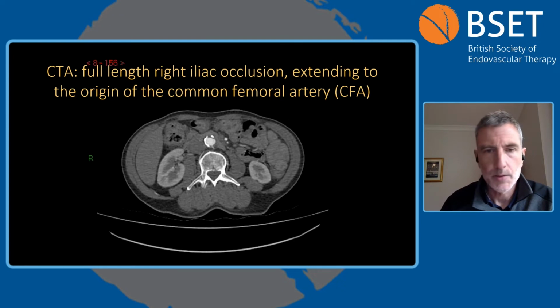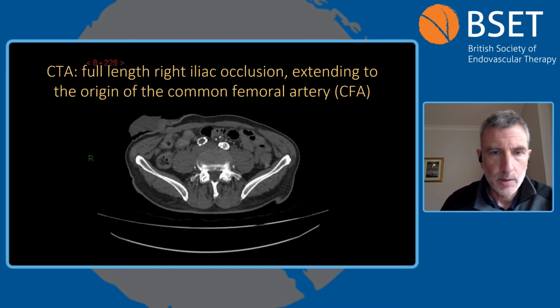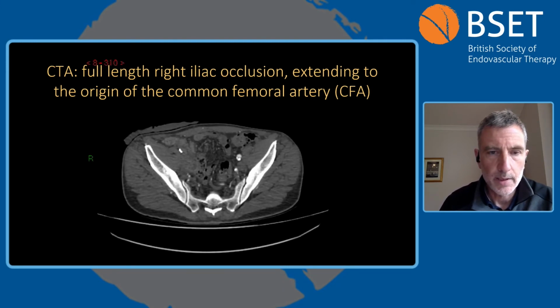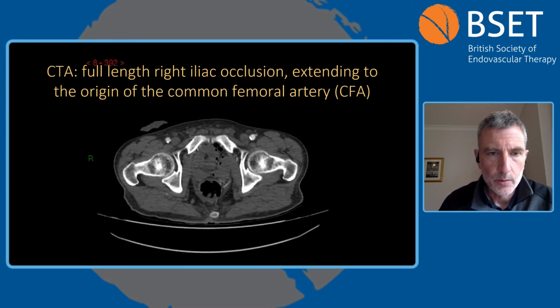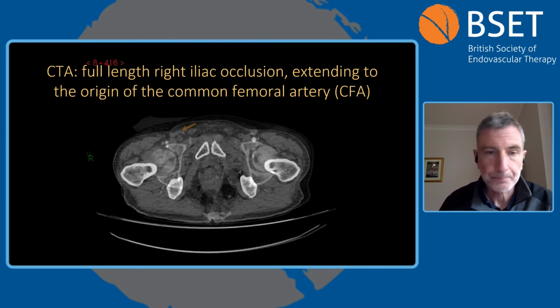And this is his CT angio. Hopefully I can just run through the axials. And this now shows that he's got full-length occlusion of his right iliac system right down to the origin of the common femoral artery. No significant disease in the common femoral.